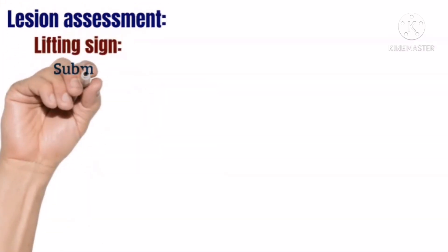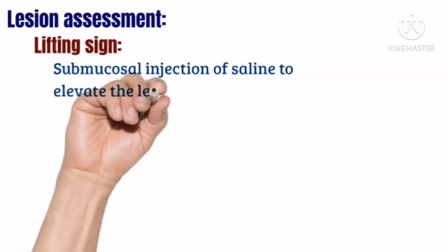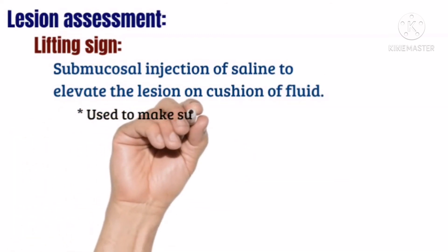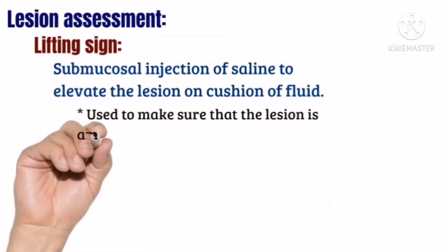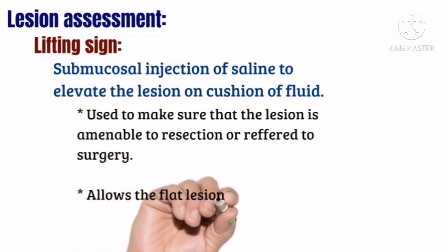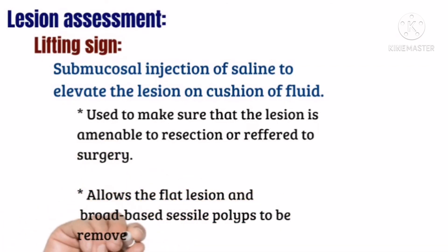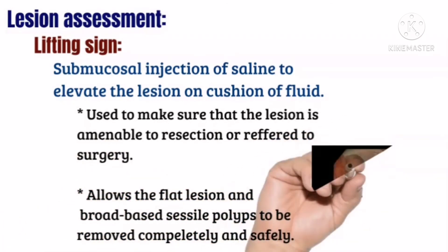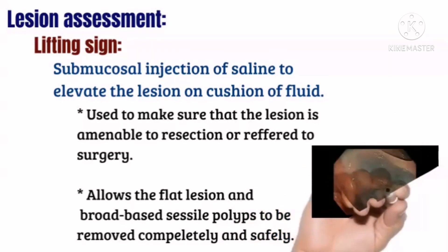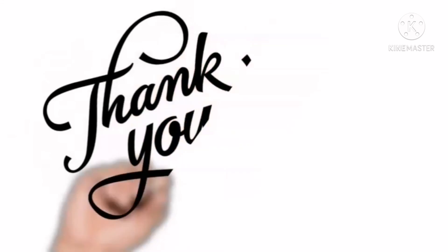The lifting sign involves submucosal injection of saline to elevate the lesion on cushion of fluid. It is used to make sure that the lesion is amenable to resection or should be referred to surgery. It allows flat lesions and broad-based sessile lesions to be removed completely and safely.